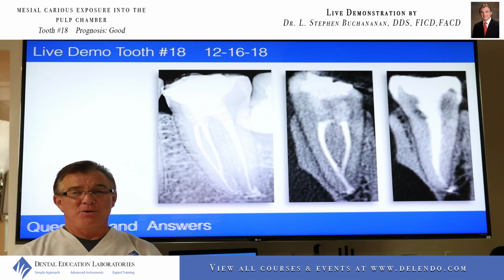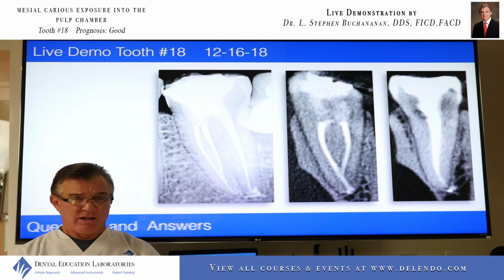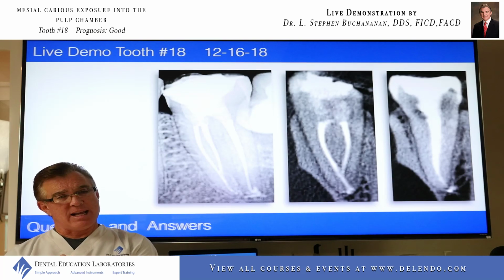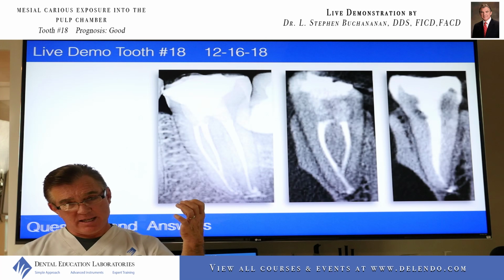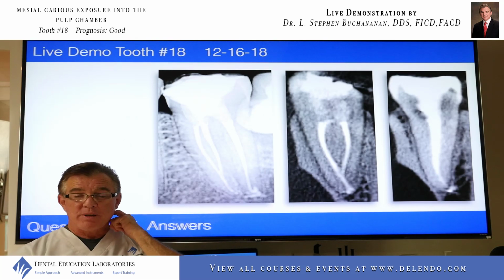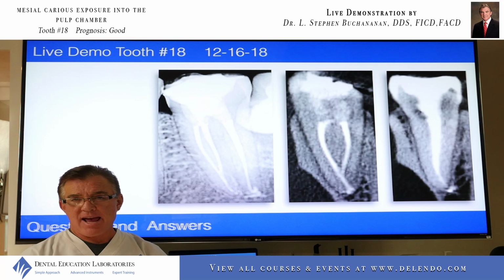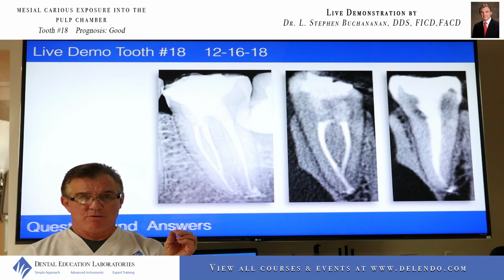I think the point of the whole treatment routine and learning a predictable procedure to use with any sealer is we have to have the narrowest constriction, the narrowest diameter at the end of the root canal. If it's originally inside the canal because of resorption, we need to cut a shape that moves it to the end, and then we need to fit a slightly less tapered cone in that opening, about a ½ millimeter short. And if we do those two things, the only surplus we're going to have really is from accessory canals branching off in the apical third.